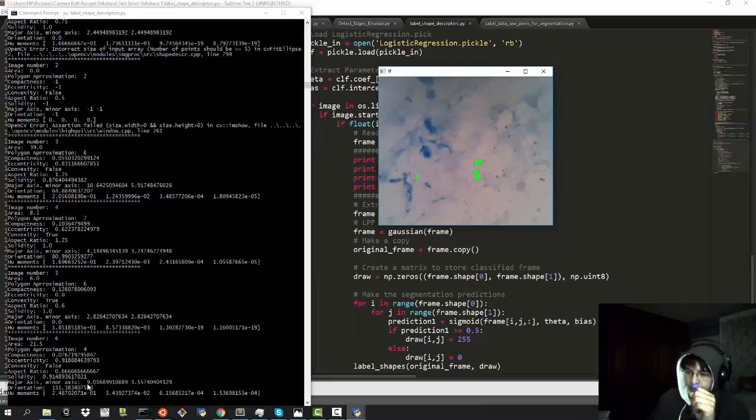And another one, which I forgot, I had a very good reason for that: the convexity, which is false. It's not true. Convex forms have defects, points at which, if we make the contour of this convex hull, we can make triangles, and that's something that you see very often in debris or objects that are fuchsine precipitations.